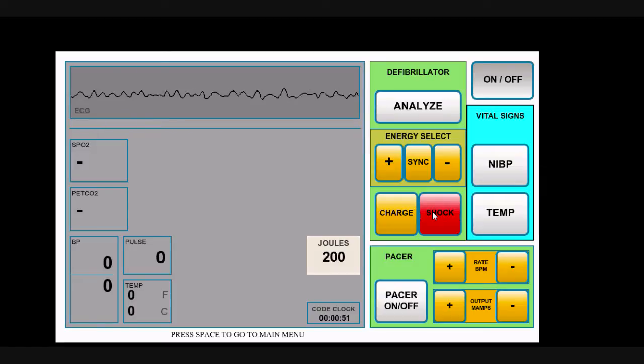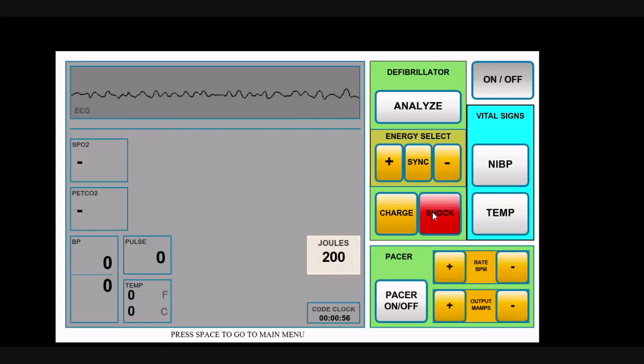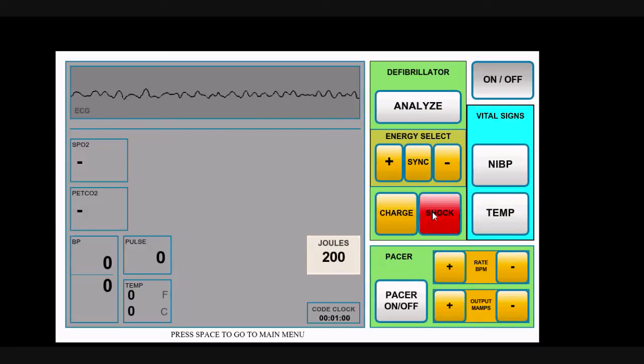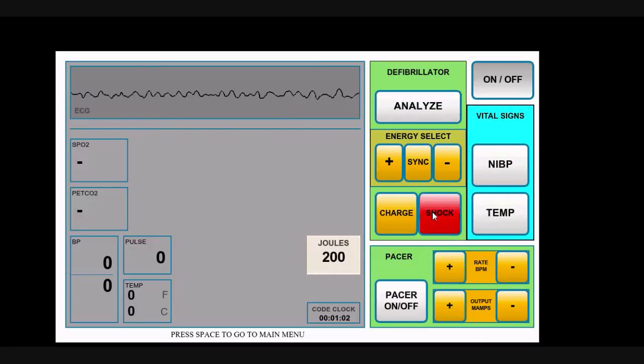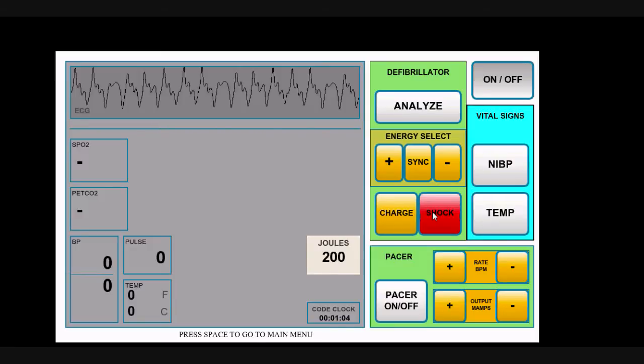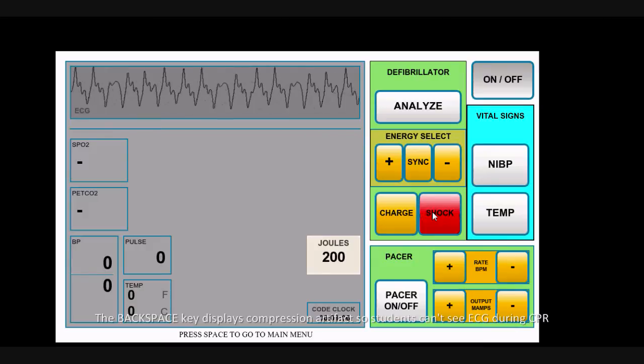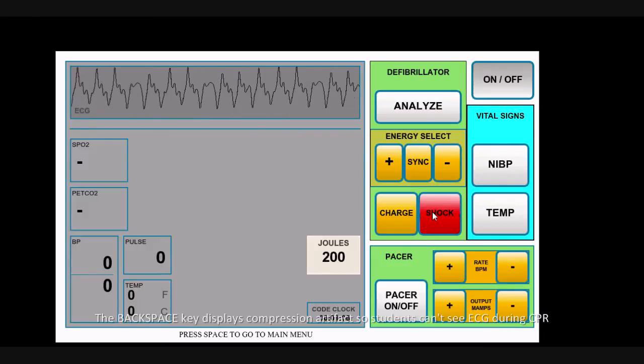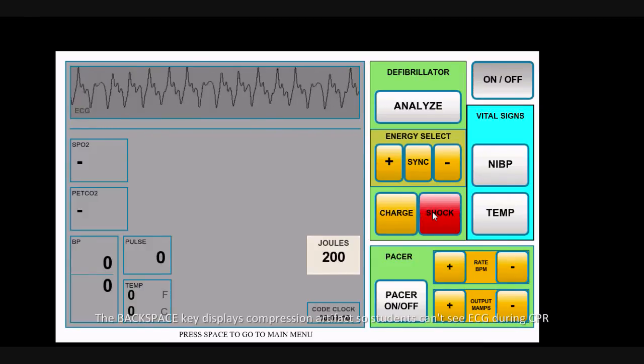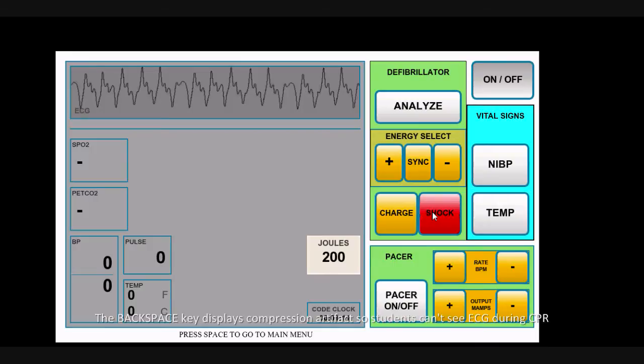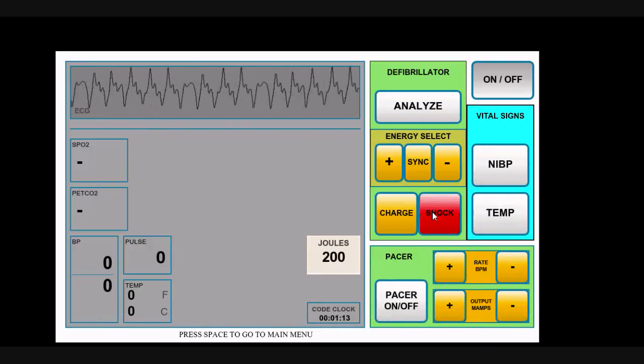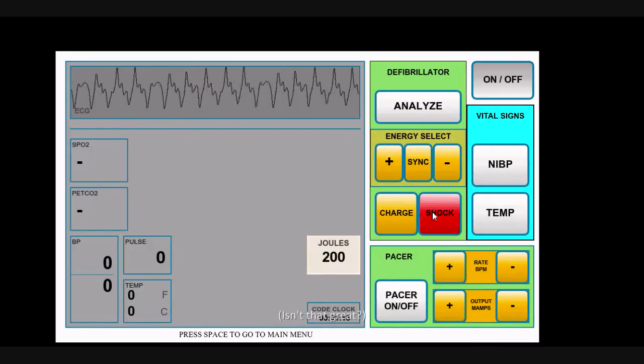Your next move from the student's perspective would be to begin CPR. We built in a feature that we think is kind of neat, which is compression artifact. If your students begin banging away on the mannequin and you hit backspace, it obscures the ECG with compression artifact so that the student can't really see the rhythm while CPR is going on. This gives them a good sense of interrupting CPR for rhythm analysis when appropriate.